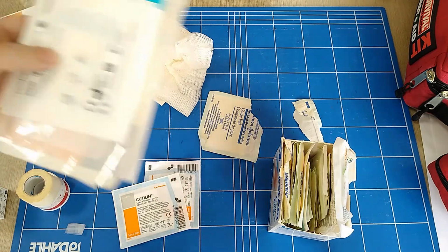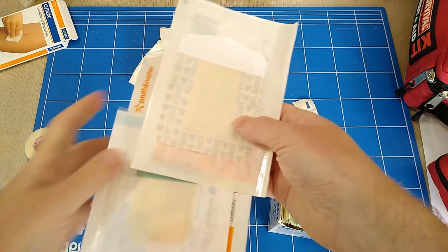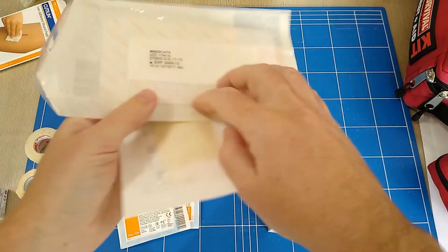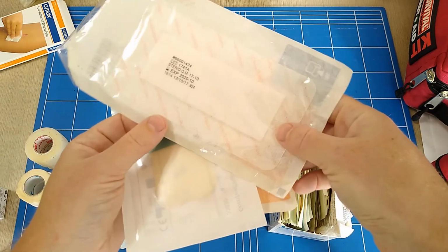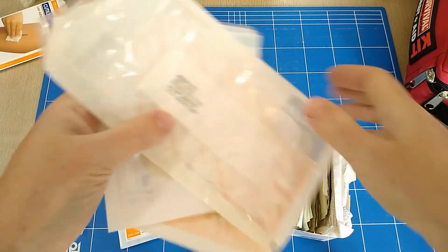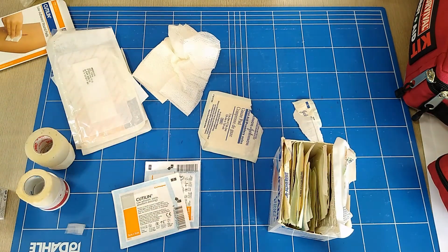Now you can also get different kinds of pre-packaged dressings, like this OpSite with a pad in the middle. Okay, this one has got the Cutiplast, and that will cover up a pretty big wound. Now, when it comes to things like expiry dates, that's on two things. That's on whether or not the packaging is probably still sterile. Obviously, if the packaging has been opened, it's not sterile anymore. That may or may not be a problem for you.